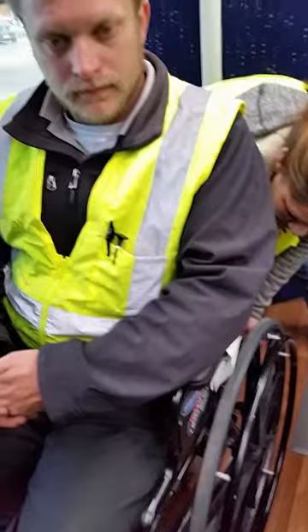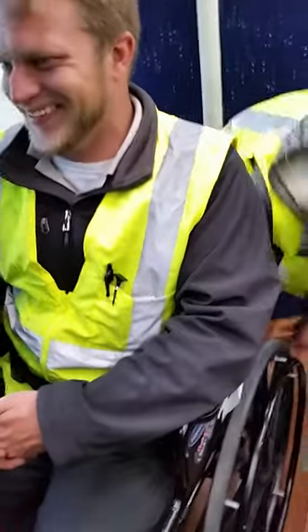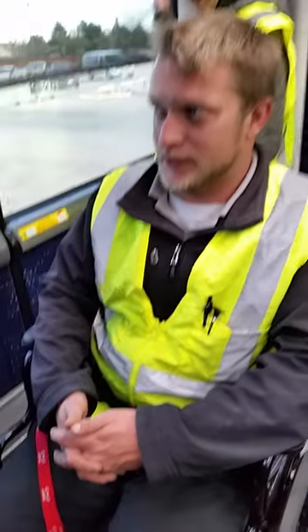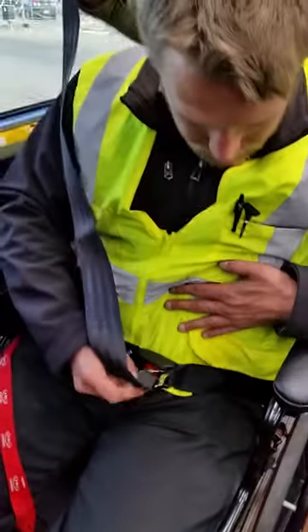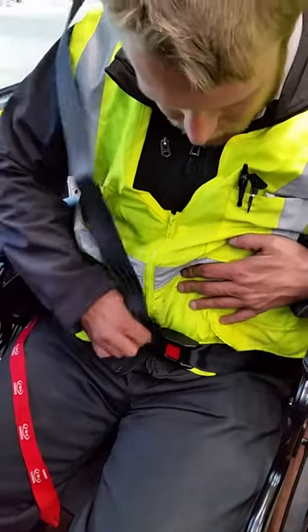More tighter on this side. Is that tight? You might want to loosen the other one to move it over. Are you good? I'm good. Pull the lap belt, and it hooks. There you go. And it hooks to the front.